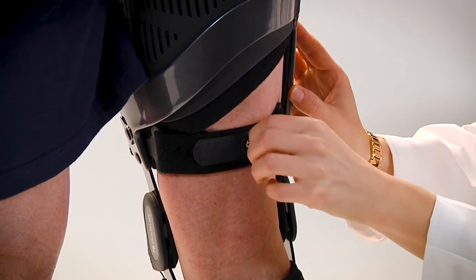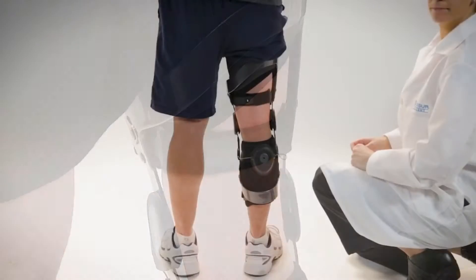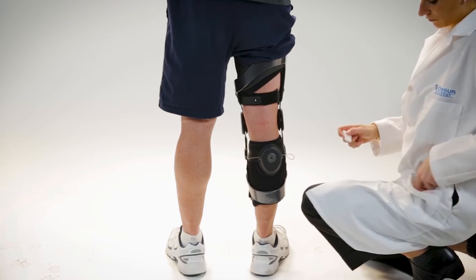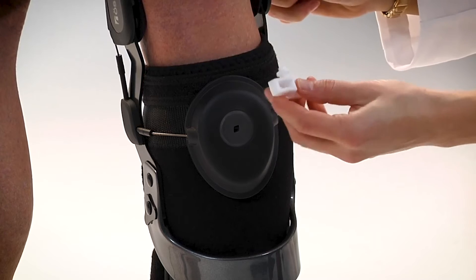Remove the numbered sticker, as the patient will not adjust the strap further. With the patient standing up and leg fully extended, place the required shear knob in the diamond-shaped hole on the spool of the dynamic tensioning system, the DTS.